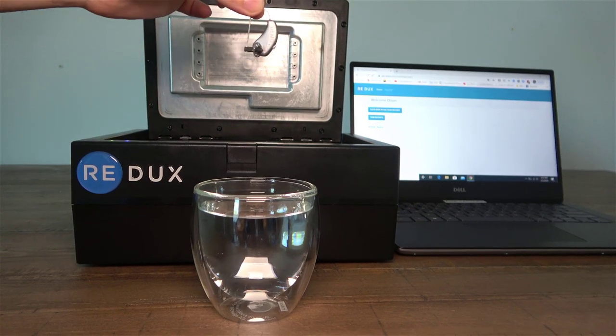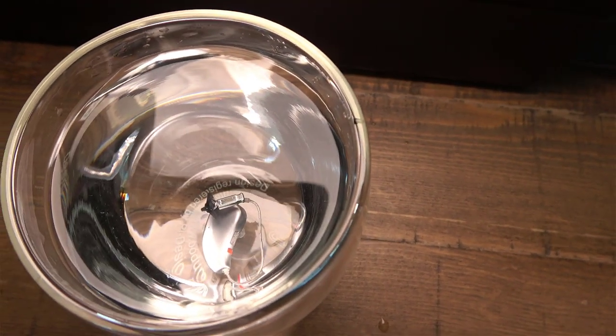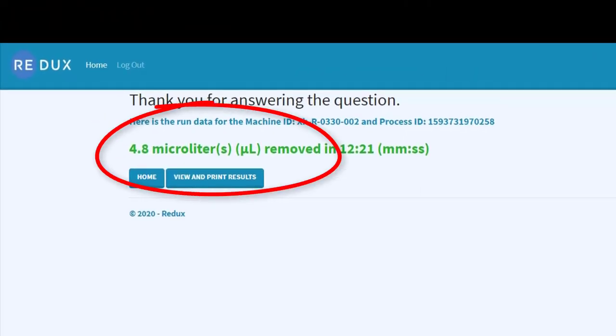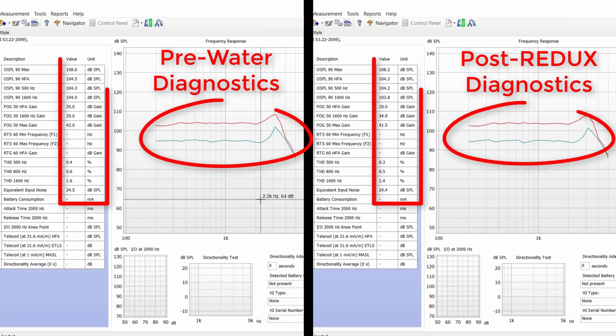So to test how well the Redux removes moisture from hearing aids, I conducted an experiment to see if the Redux could revive a hearing aid submerged in a glass of water until it stopped working, back to the same level of performance prior to its water exposure. And sure enough, the Redux system was able to bring a hearing aid back from the dead, and the pre and post test box diagnostic measures were virtually identical. There is no doubt in my mind that the Redux dehydration system pulls every last speck of moisture out of a hearing aid, and it does all of this in about 12 minutes — significantly more effective and quicker than any at-home dehydrator, and definitely better than sticking your hearing aids in rice, which by the way has never been scientifically proven to actually remove moisture from electronic devices.